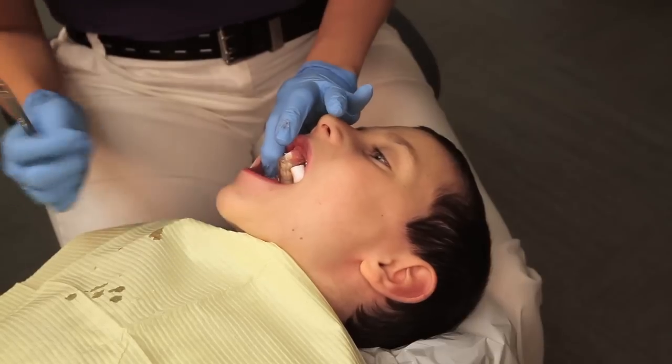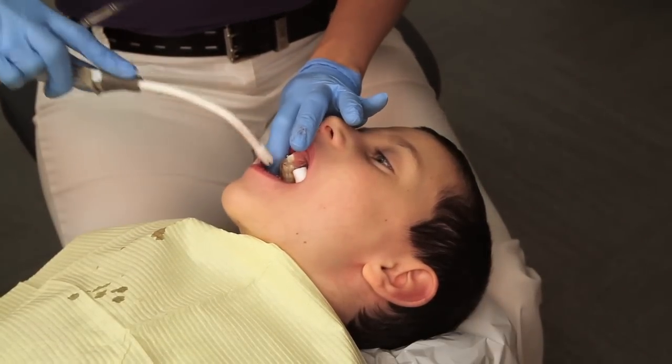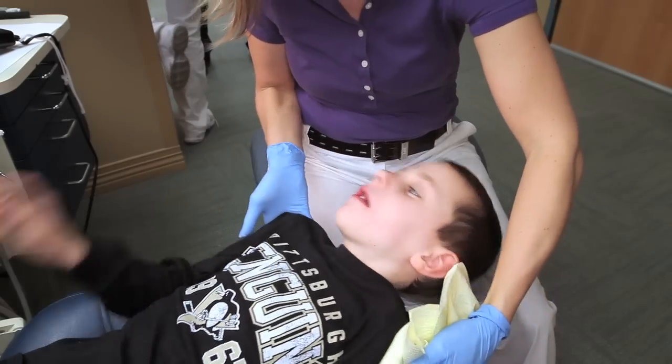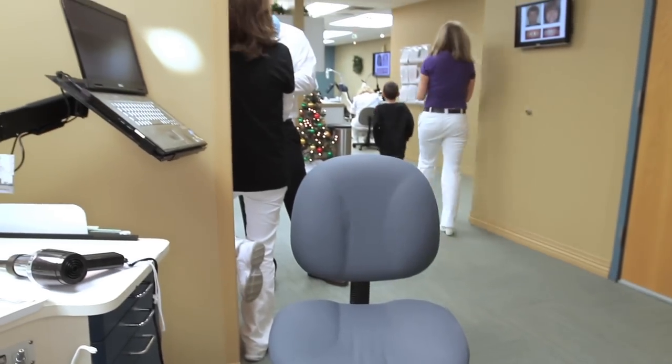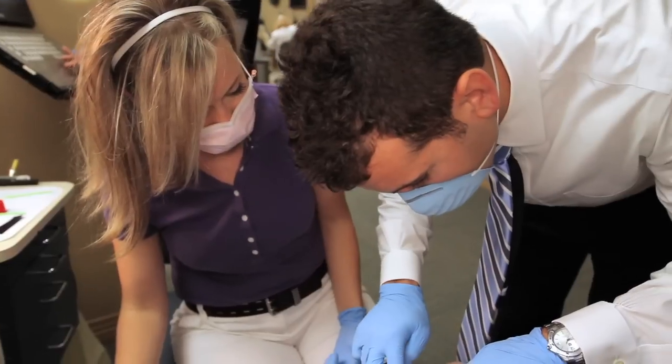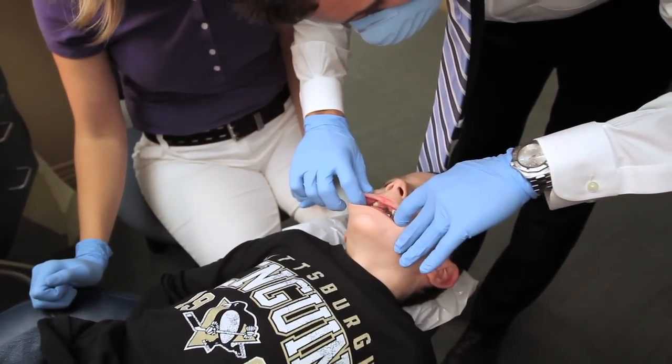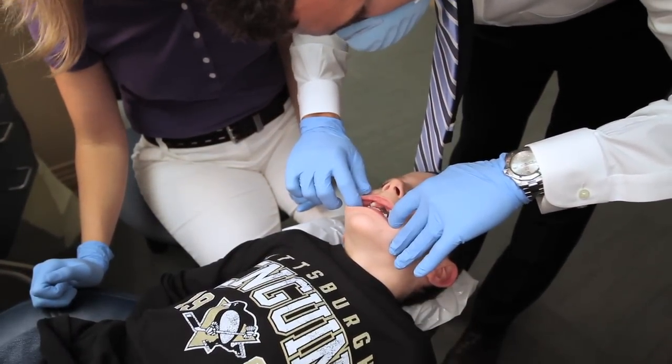The patient manager will clean the excess adhesive. Once the excess adhesive is removed and it has fully cured or hardened, the patient can go to the sink and rinse. The orthodontist will do a final check of the expander, making sure that the adhesive was removed in a way that allows the patient to maintain proper oral hygiene. He will also ensure that the patient is biting evenly and that the expander is comfortable.